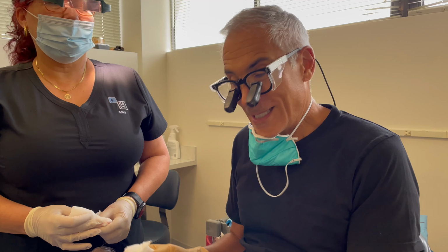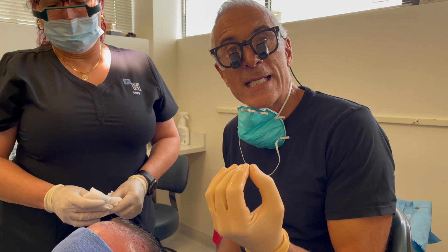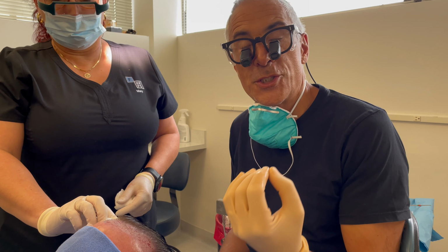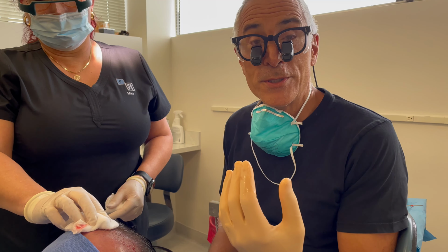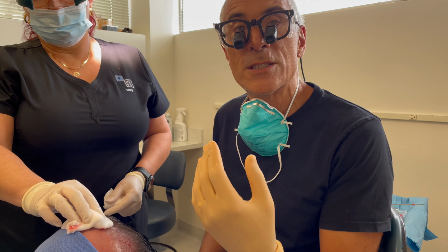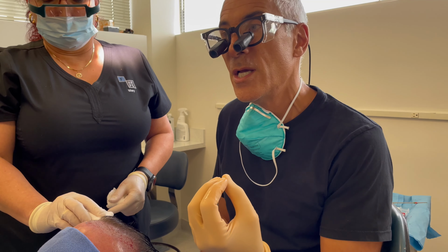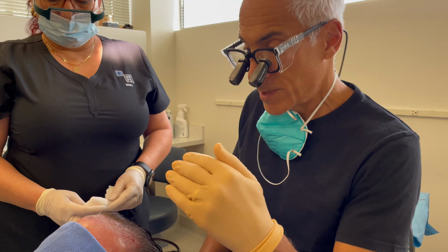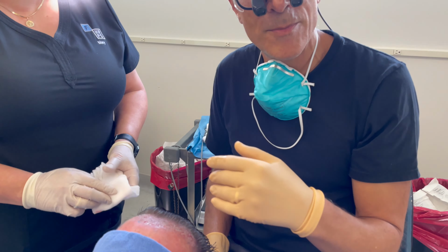I'm giving a tip. Actually, this is going to be 2 tips in 1. This is on a technique I utilize for achieving maximum density. It's a pretty simple tip, but it's something I've started doing over the last few years, and it really has made a difference. It's a matter of changing your perspective when you're doing a transplant from the side, sitting, versus coming up from above. And I'm going to demonstrate that.